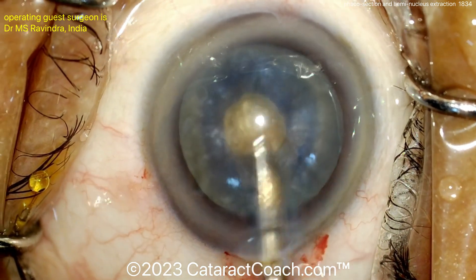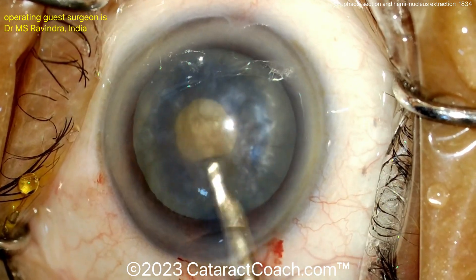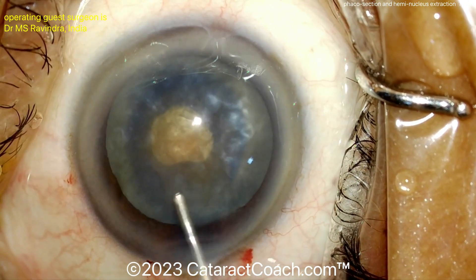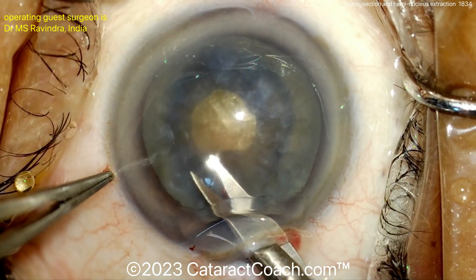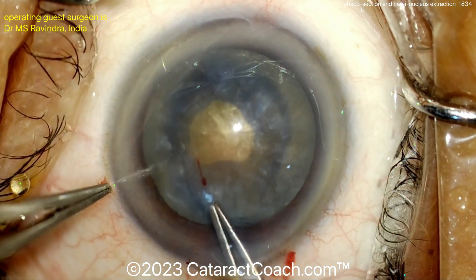Luckily this capsular bag is not very highly pressurized at this point. Coming in with a Simcoe cannula just to wash out a little bit more, really making sure that nucleus is decompressed. A little more viscoelastic going inside the eye. Now at this point the double rexis technique — it's time for the second rexis.